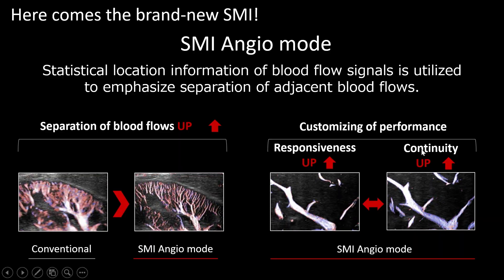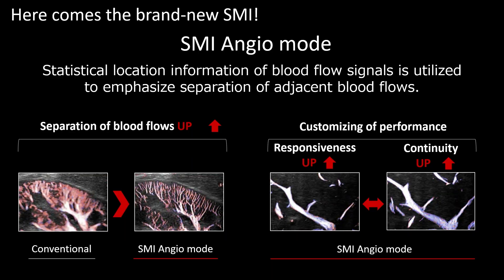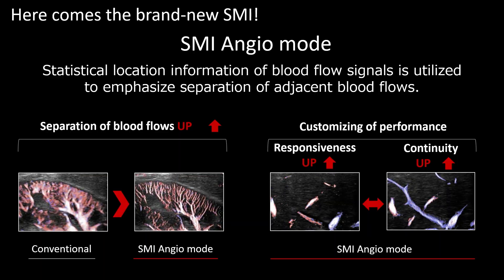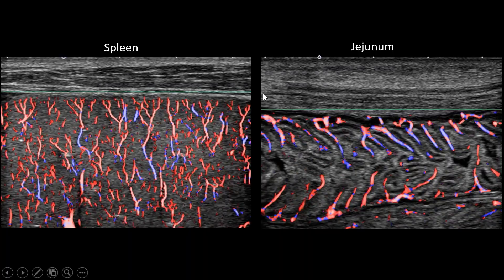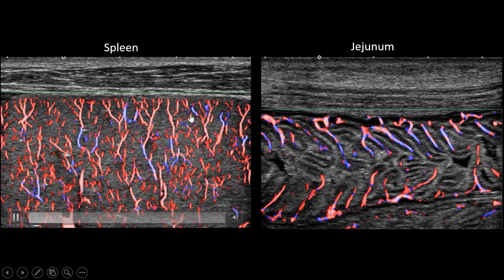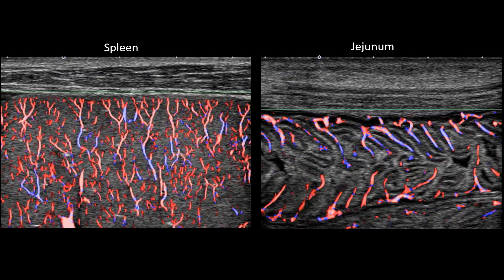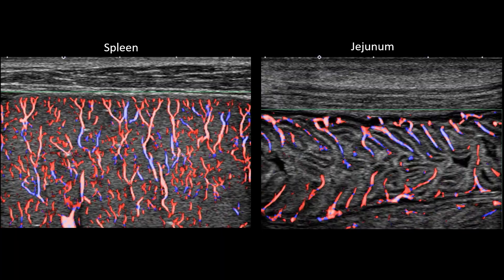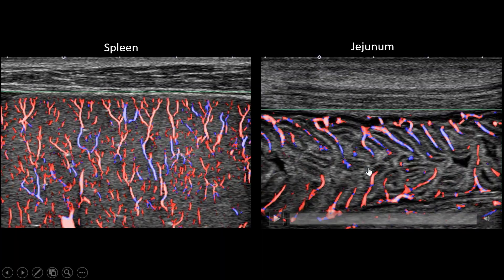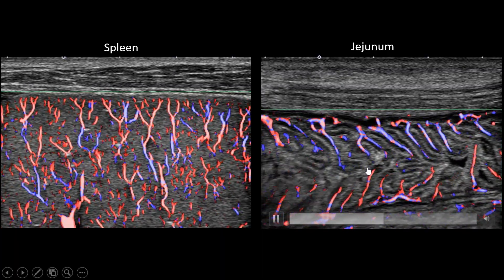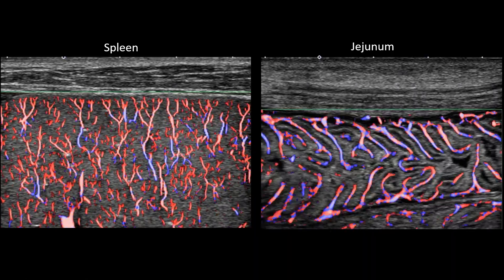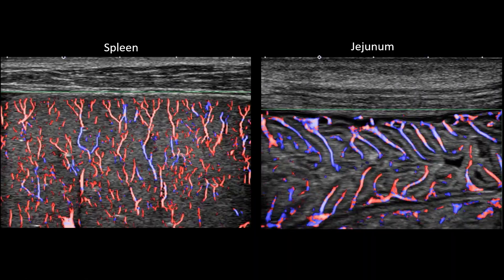If you want to see the continuity of the blood flow, you can also customize the performance by changing the mode. This shows the blood vessel structure of the spleen using the new SMI, and this shows the jejunum blood flow — you can see each blood vessel in every fold.